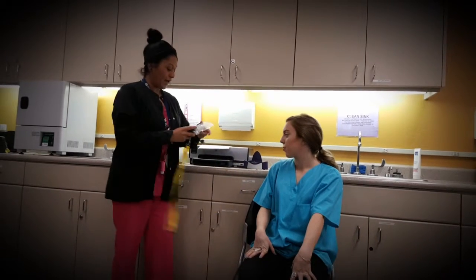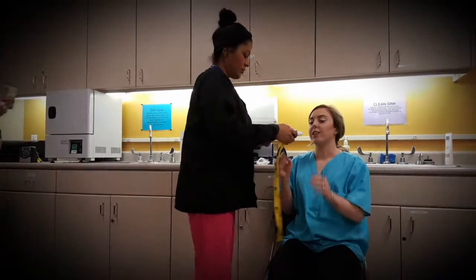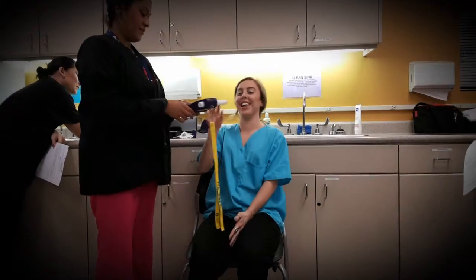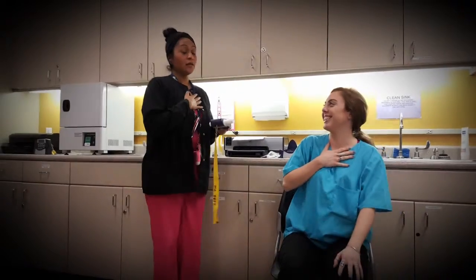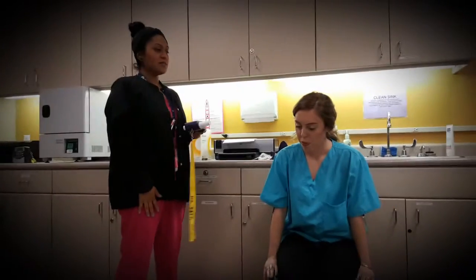When you give the patient the mouthpiece, have them put their mouth around it so it creates a seal with no air escaping. Coach them through it: take one deep breath in and blast out — keep going, keep going, you're almost there, you can do it. Whatever it takes to encourage the patient. It takes a lot out of them — they might get dizzy or feel like they're going to vomit. That's completely normal. Give them breaks and make sure they feel comfortable and not embarrassed.